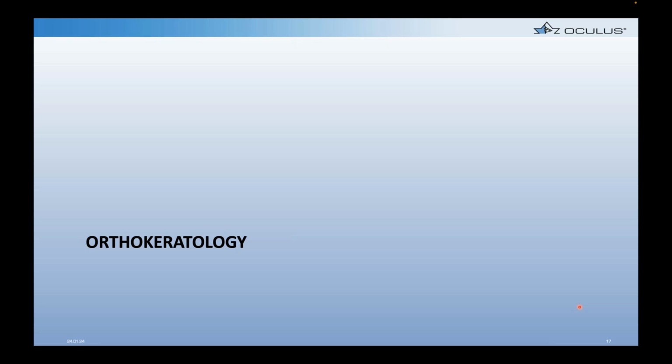Again, we use this device a lot for our ortho-K patients. There was a time some years ago when we were still doing a lot of ortho-K, and I just felt like my keratograph, my placido disc topographer, was adequate for fitting and managing my ortho-K patients. And what I came to the realization was a few years ago that in order to be more efficient and effective at getting fewer remakes and getting my fit faster, I needed the full corneal data that a Pentacam gives.